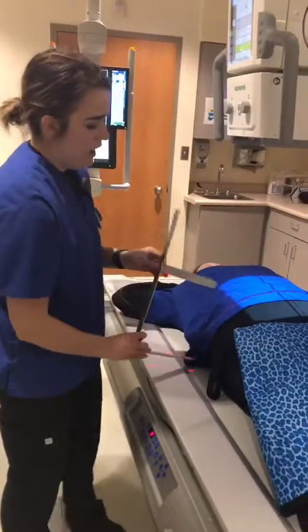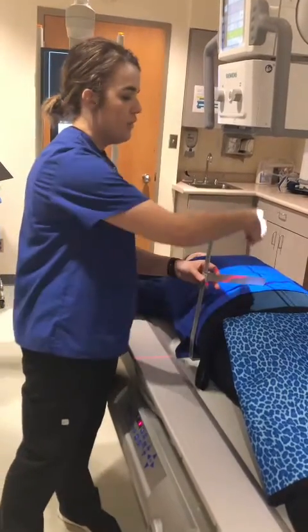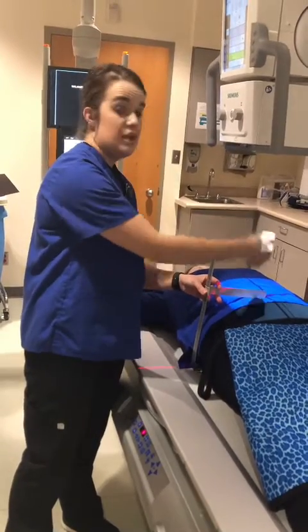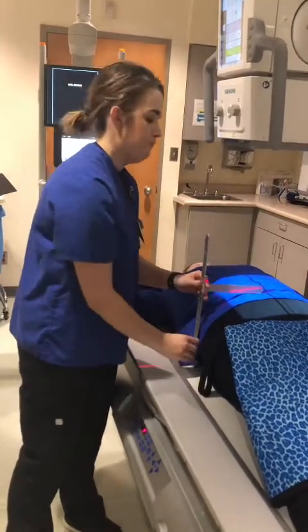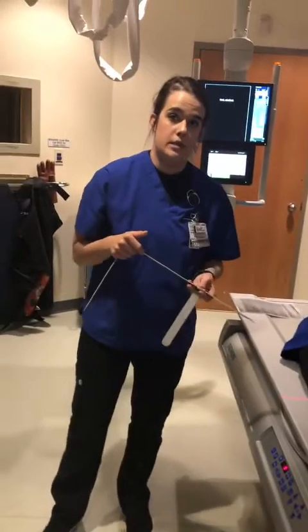So I'm going to stick these calipers, making sure they're right under the patient, and then making sure they are going through the central beam where the beam is entering and then where the beam is exiting. So I'm going to pull these out, and the patient measures 24 centimeters.